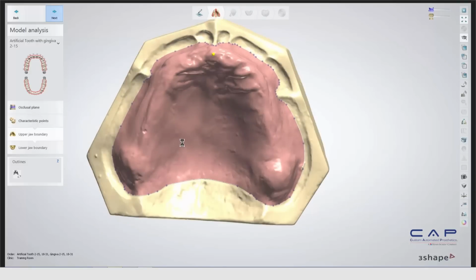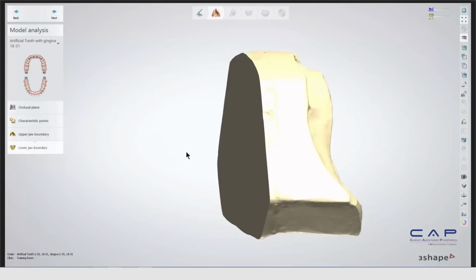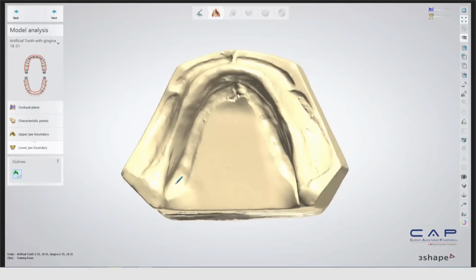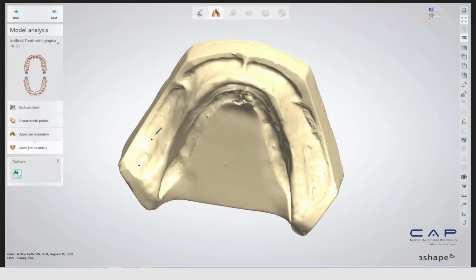Yeah. Now we're going to go on to the lower boundary and do the same thing. We're going to click on the little outline box here, and if you want, you can do the series of clicks, but I'm just going to left click and draw just because it's a little bit faster, and then we'll make any changes afterwards.